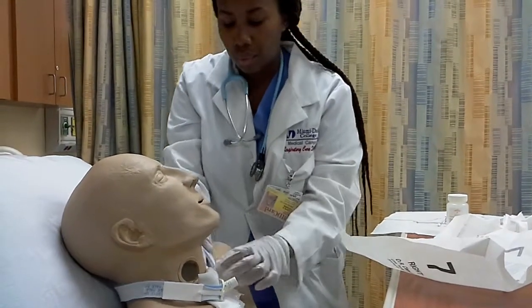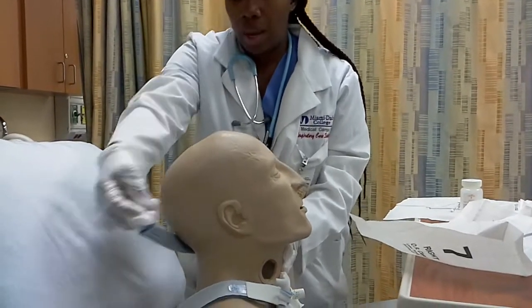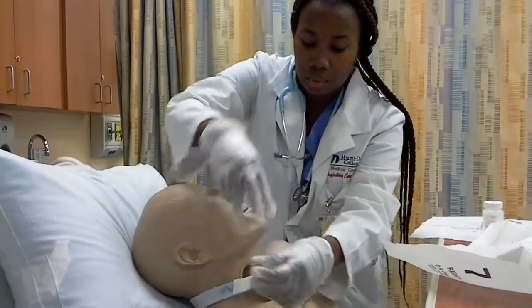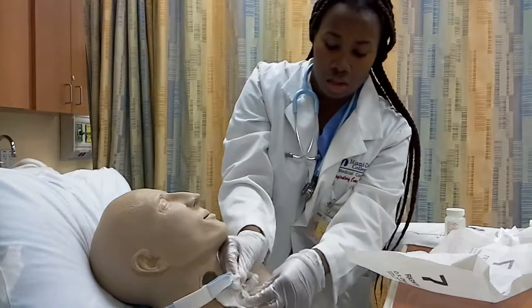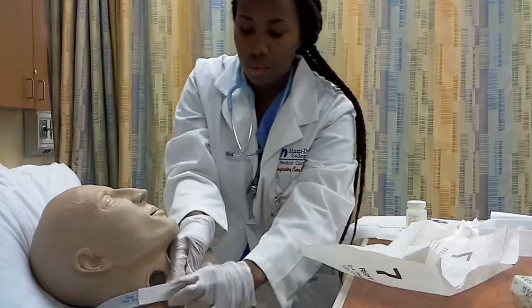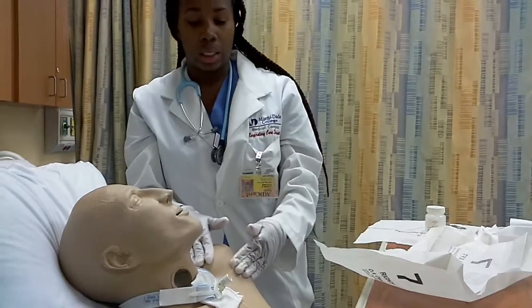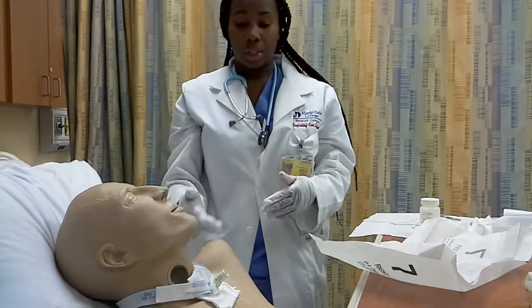Okay. So then I'm going to sit my patient up. That way I can go move around. Then I'm going to unloose this one, and attach the new one. Okay, so now that I have attached that one, now my patient's trachea area is clean, his stoma is clean. I assessed everything to make sure there was no redness or skin breakdown or any irritation.